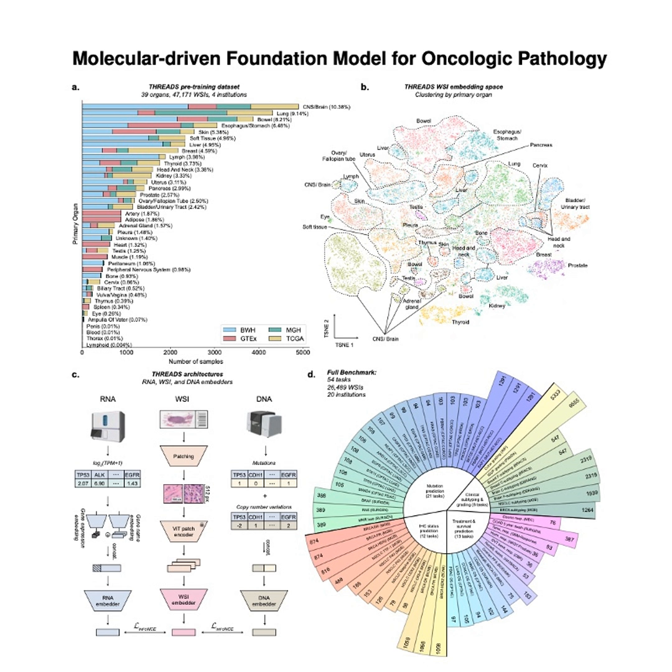Think of it like building a universal visual dictionary for tissue. It's a massive AI, pre-trained on tons and tons of general data. So it learns fundamental stuff, like what tissue generally looks like, what cancer cells often look like across many types. It learns these really rich, abstract representations. And the beauty is these representations can then be instantly transferred to specific, much smaller clinical tasks. That's called transfer learning. So you don't have to start from scratch building a model for every single little question.